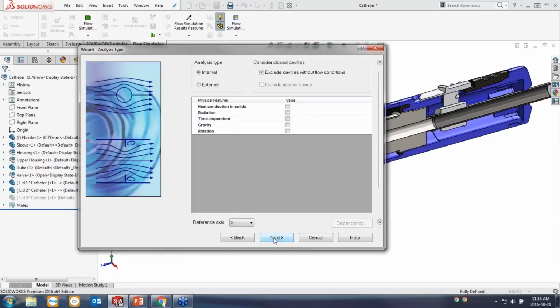We're going to start with an internal analysis where all of the flow is inside our geometry. But we'll actually take a look at an example on this same device later on where we're running an external analysis. There are some other options which I'm not going to use here, but we can incorporate thermal analysis. We can turn on a time-dependent study, so this is a transient analysis. We can include buoyancy effects, and we can even have rotating regions if we have things like pumps in our model.